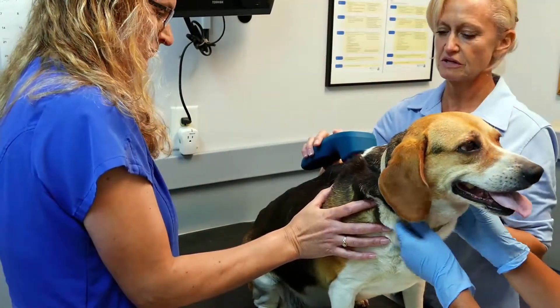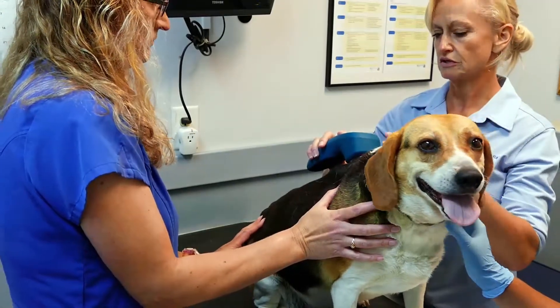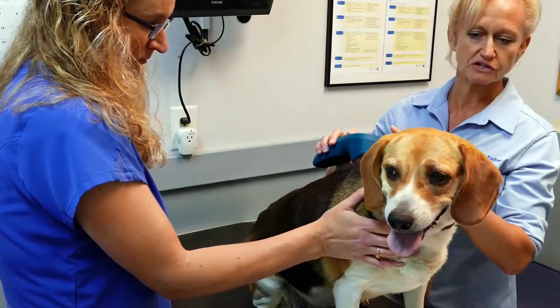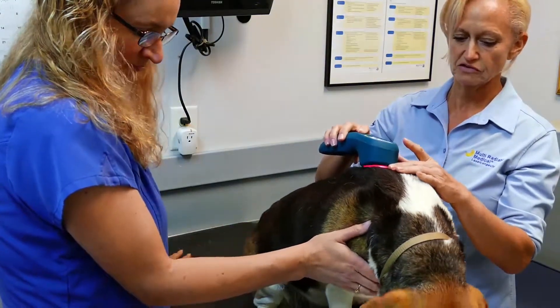This should help calm her down a little bit too. It will also help to deliver pain relief to your whole body because, as you know, all the nerves generate from the spine. So it will even reach down into her little leg. She might flop down — that's not unusual.